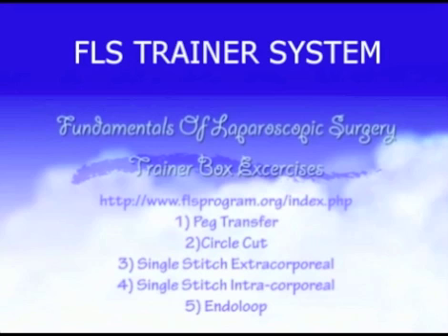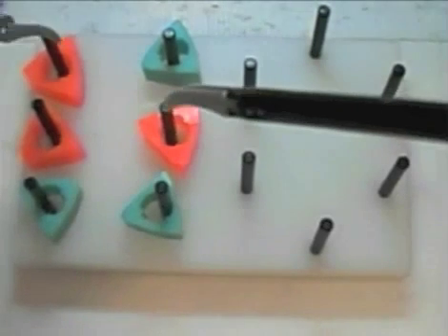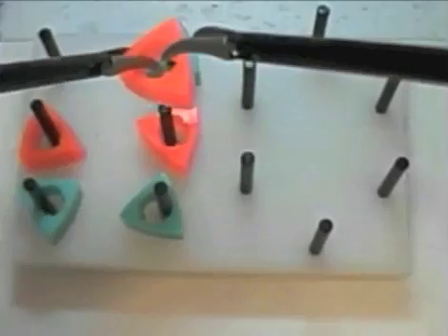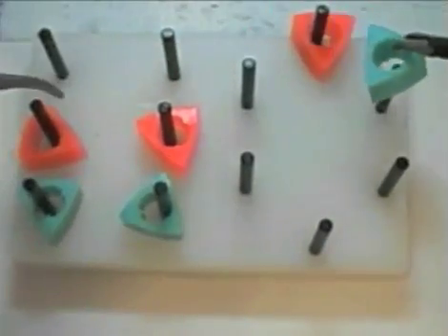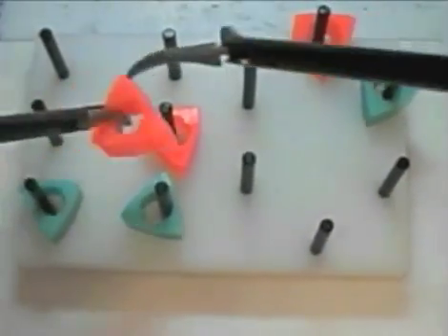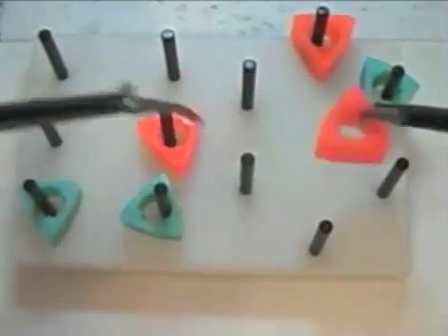Task number one, peg transfer. You are given two graspers for this task. The goal is to grab the peg with the non-dominant hand, transfer it to the dominant hand, and place it on the opposite side of the board. There is no importance given to the color of the peg and ignore the order in which they are transferred.